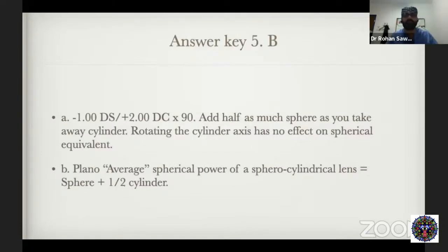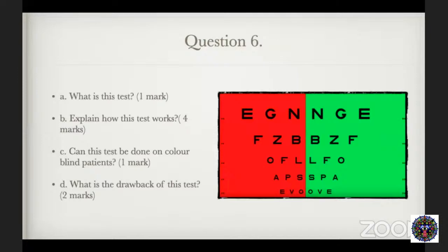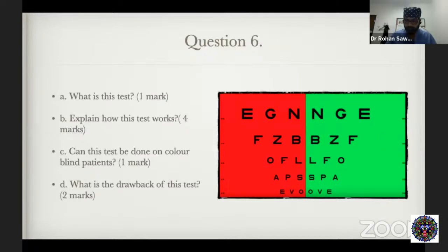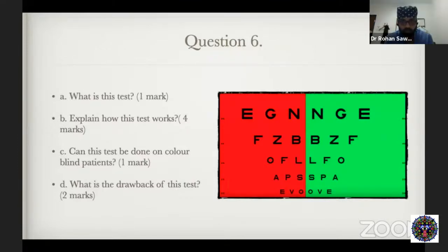Let's go to the next OSCE, shall we? Yes, sir. Okay. Right. Have a look at this picture. What is this test? The duochrome test. Okay, correct. How does this test work? They want to know what is the mechanism of this test.